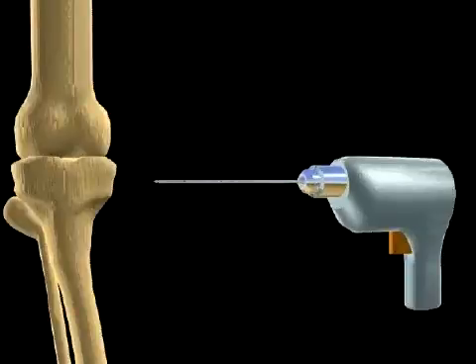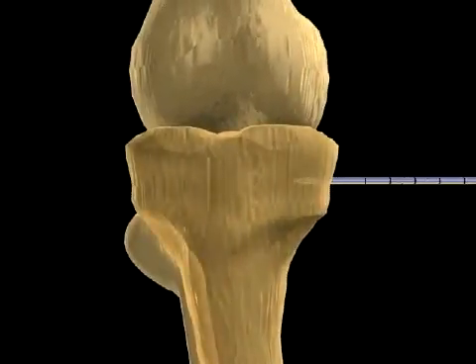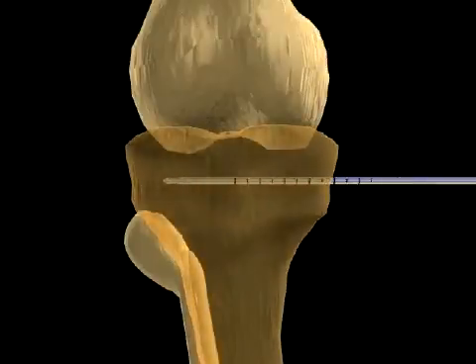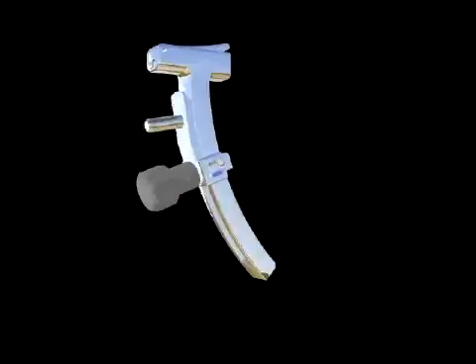Under fluoroscopic control, a 3 mm guide pin is inserted from medial to lateral into the tibia beginning 1 to 2 centimeters below the joint line at a point central in the AP plane and parallel to the tibial plateau. The pin is inserted to the lateral cortex.